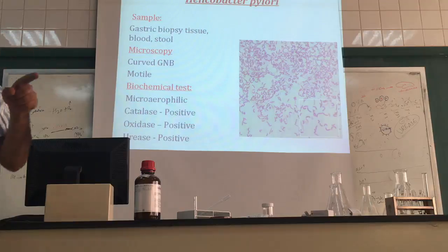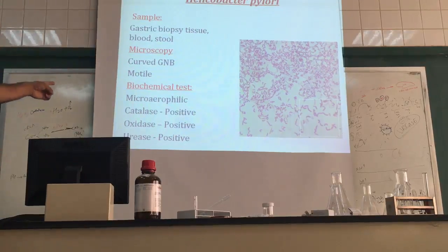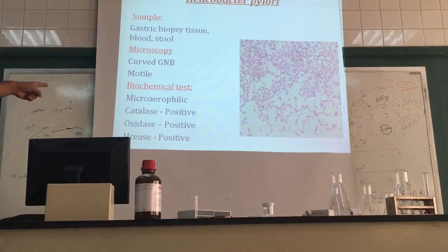This means at a higher concentration of oxygen, it will die. Higher concentration of oxygen. You see this catalase? Positive. This means the catalase enzyme is present. Oxidase? Positive. And urease? These are the three properties of this.